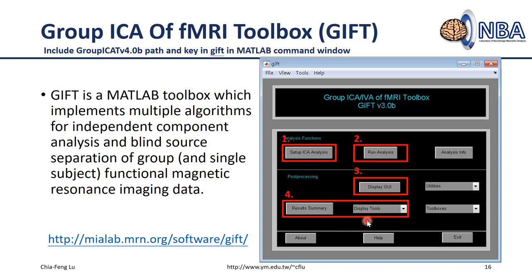You can use the GIFT toolbox to perform group ICA analysis. If you only have one single-subject dataset, you can still use the same toolbox — the operating procedure is exactly the same.